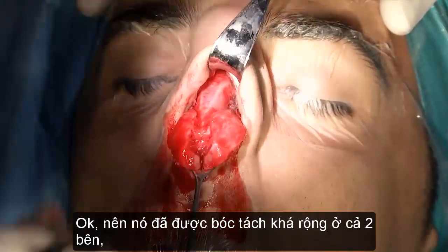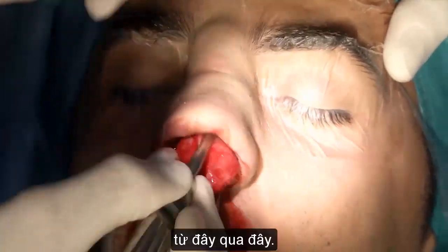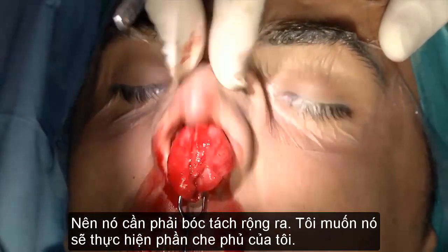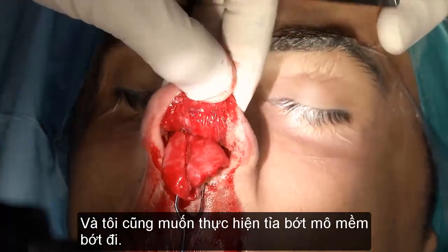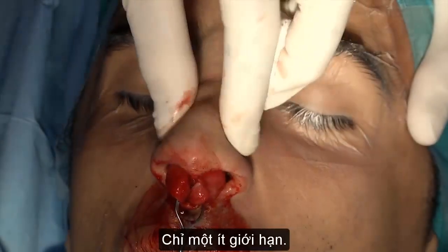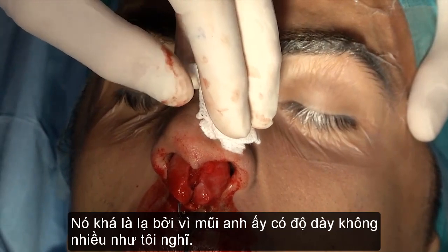Okay? So it's wide degloving on both sides from here to here. All right, so this is indeed wide degloving. I want this envelope to do its work. Should I need to do some debulking? Yes or no? Well, I want to do some, just limited. It's pretty strange because he has less thickness than I had thought he had.